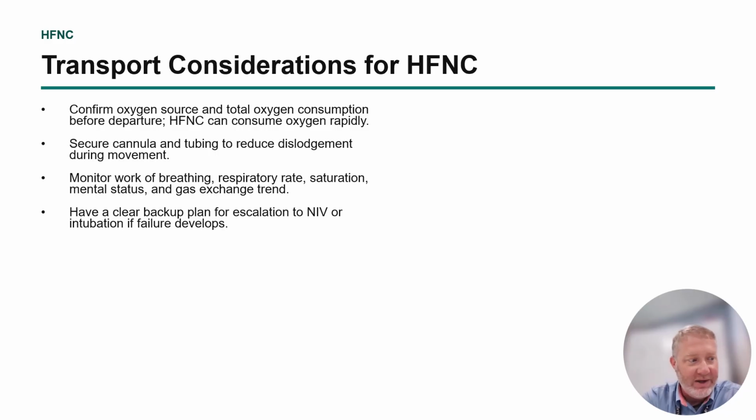And then finally, have a clear backup plan to escalate to either non-invasive ventilation or intubation if they fail or don't tolerate it, or if the high flow nasal cannula itself does not seem to be doing the trick.